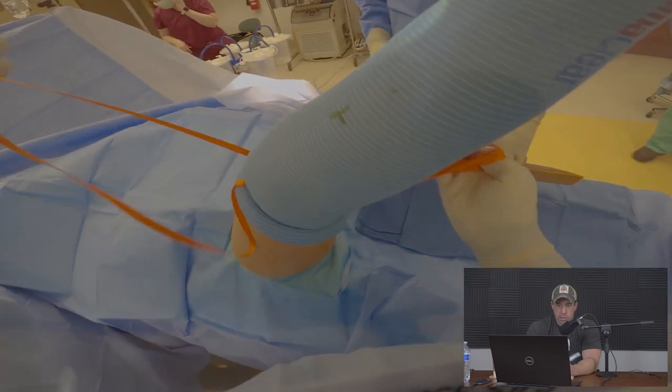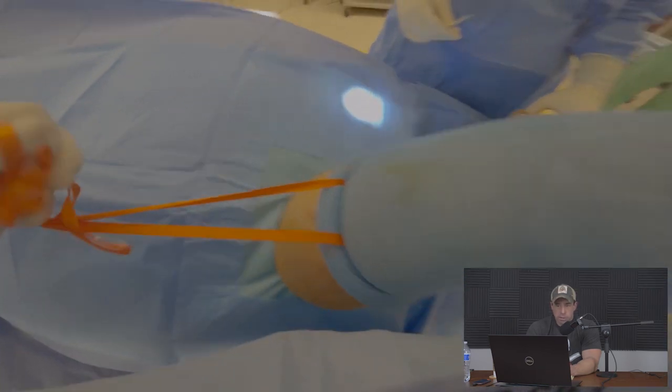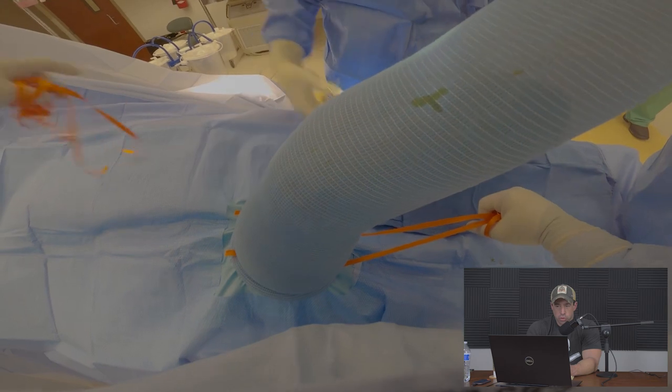You can see that this patient's knee does not quite fully extend at the beginning of the procedure, so we spent some time doing soft tissue releases and other measures during the surgery to restore this.